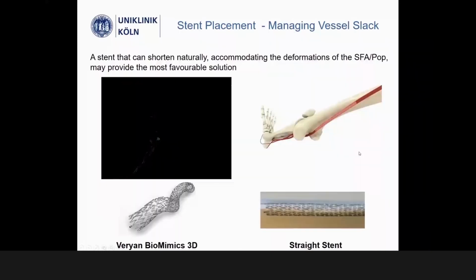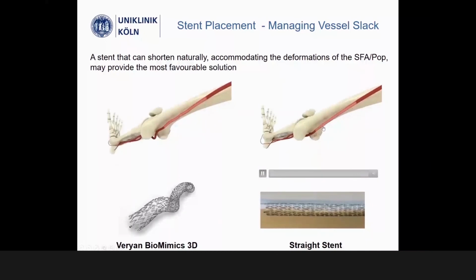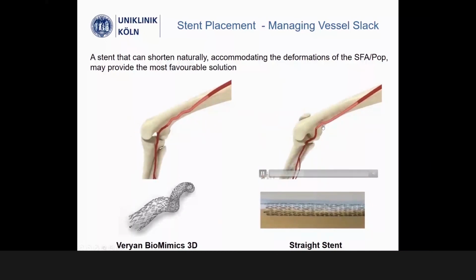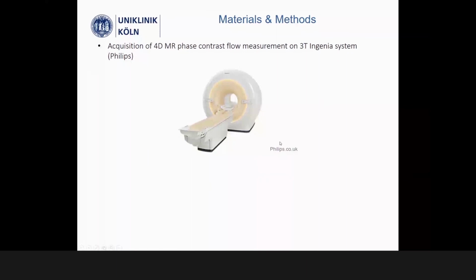And this is different if you implant the 3D biomimic stent, which is actually of benefit to the action of the stent. Whereas in a straight stent, the stent could even bend. So I'll continue with our experiment.